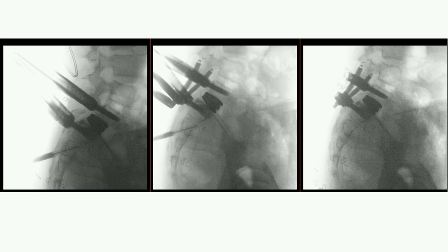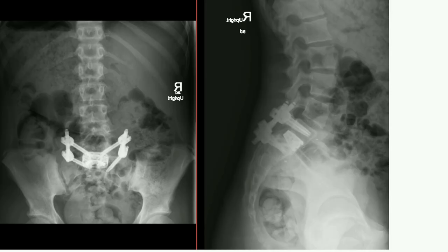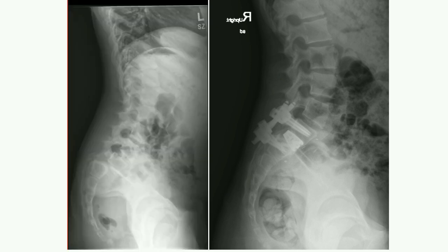I've had several that over-reduced. Using the rod almost like a fishing pole, you lean back on it and it creates leverage to reduce L5 onto S1. This was the result. The asymmetry is because when putting in screws with navigation, you put them where the anatomy is — the anatomy is not symmetric, so things will look asymmetric. That's her at six months.